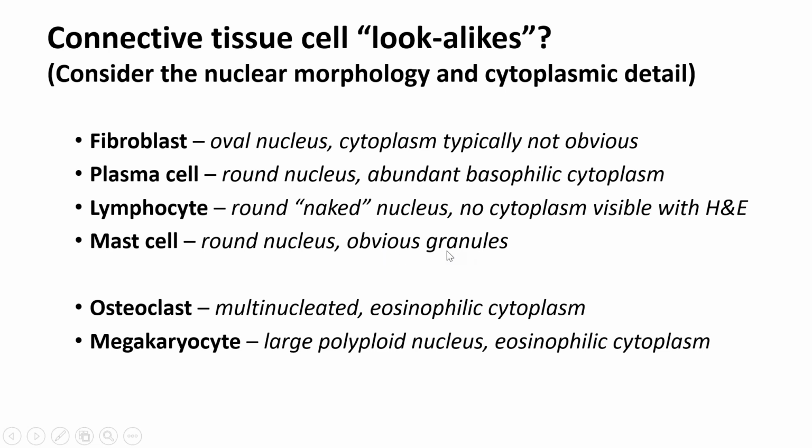And so the mast cell is involved in allergic reactions, and so it's going to have histamine and heparin, which is going to allow those blood vessels to dilate and become leaky. And so they're going to be able to be seen with special preparation.